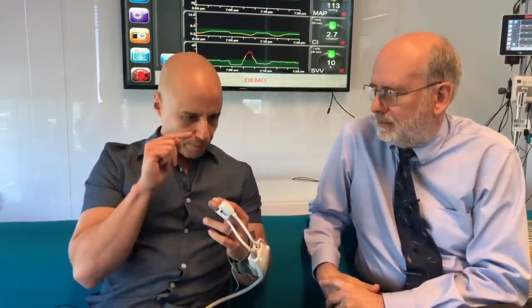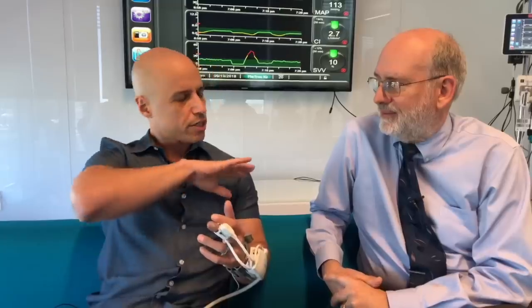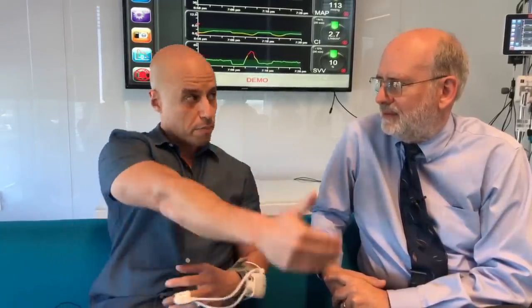The other interesting thing about this is with these data points, there are algorithms that Edwards is working on that they're calling the Hypotension Predictive Index. Yeah. It sounds like they looked at a ton of data points and said, could we actually start to anticipate hypotension based on patterns? Yeah. Well, what's the deal with that? Seems to work. So, I, Robot, I guess apocalypse coming.